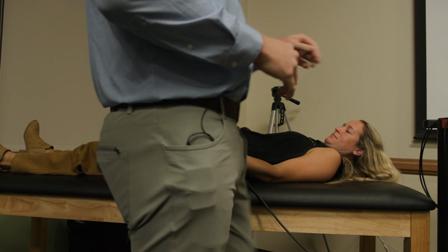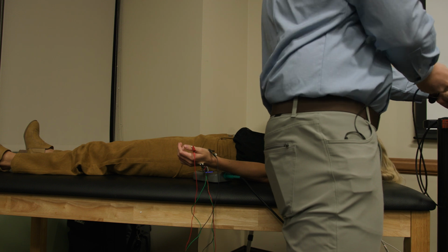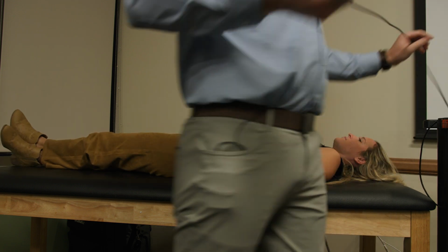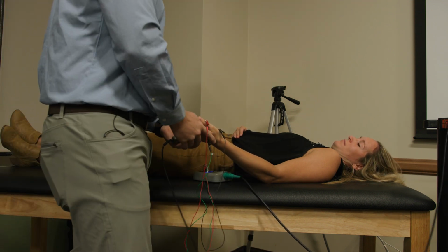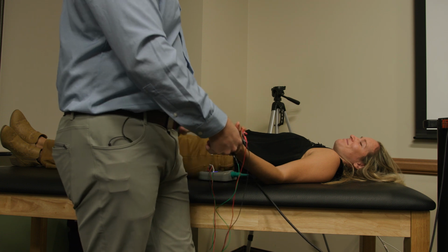And then from here, I'm just going to go through a couple nerves, the same way that I would go through with a patient, explaining what we're doing and what it feels like as we go. So Brandy, the first part of this test, we'll do little zaps up and down the arm to see how your nerve is responding.